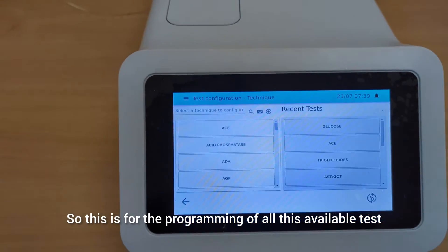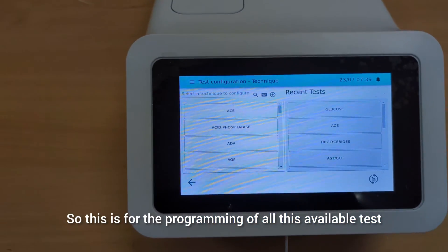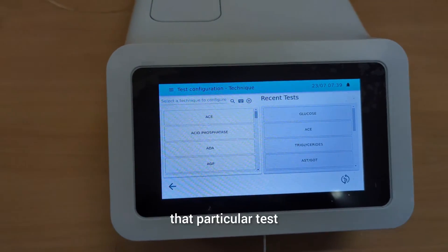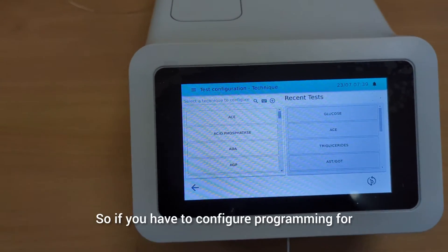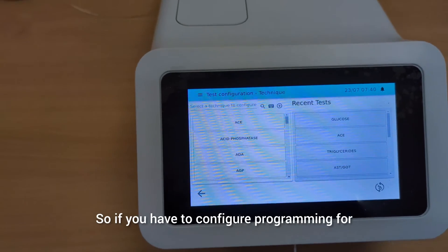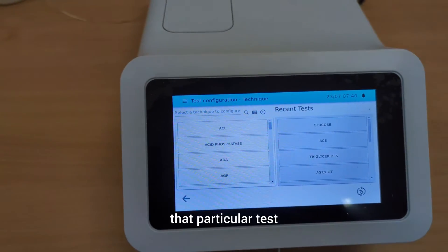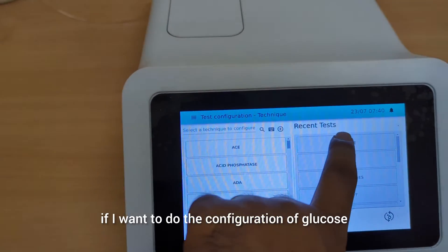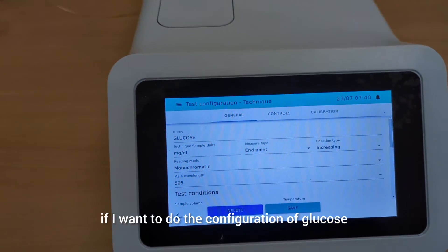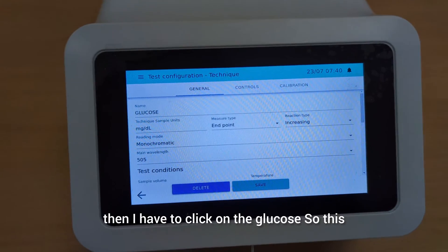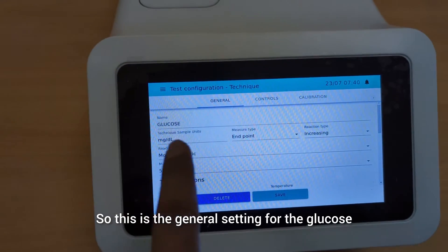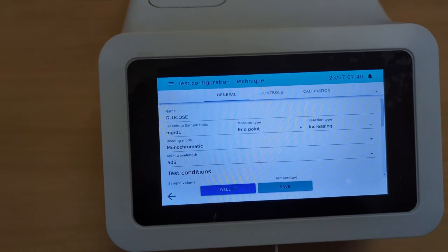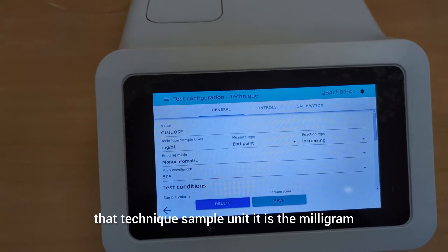Then comes the test configuration section, which is for the programming of all available tests. Different companies have different programming for each particular test. If you need to configure programming for a particular test, you have to come into this section. For example, if I want to do the configuration of glucose, I click on glucose and the heading will appear.